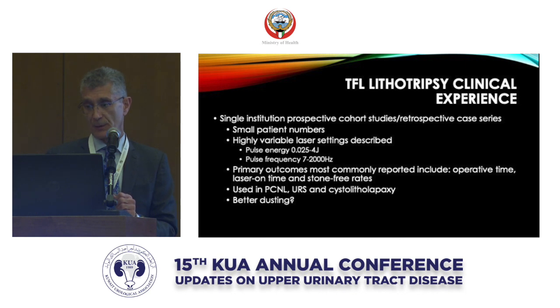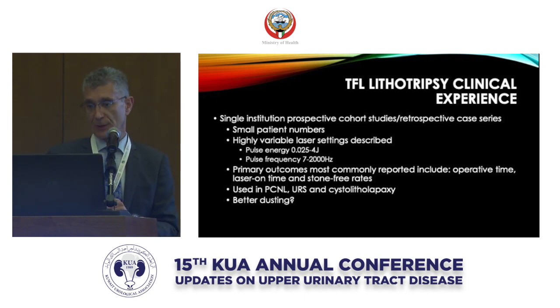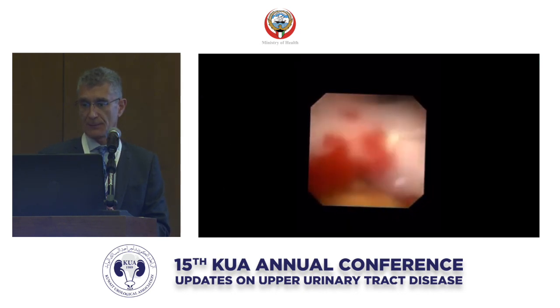And this little video here, for those of you who have seen the thulium in action, if you get it to work, I'm showing this video. This is a soft stone, which I purposely have chosen here. And you could argue the holmium is going to break this up just as well, and I totally agree. I think the point of this video is that there's a couple of things. There's very small fragments that are being produced. I don't think holmium does that as well. So you're really seeing that so-called microdust, individual particles.